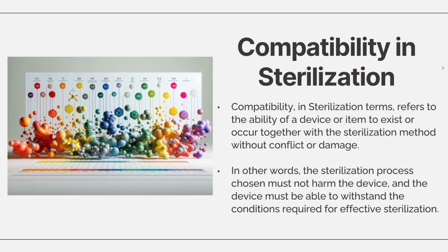All right, so compatibility in sterilization. In sterilization, compatibility means that the medical device and the sterilization method work well together without causing damage to the device or compromising sterilization effectiveness. So, this involves two key considerations.